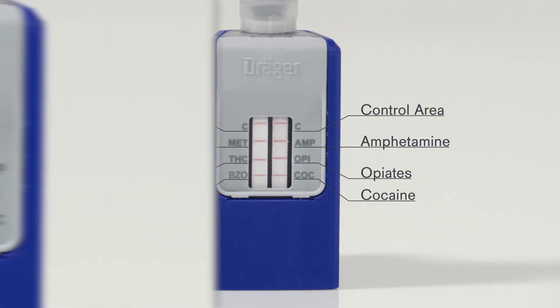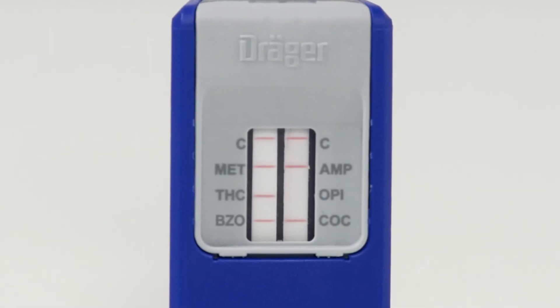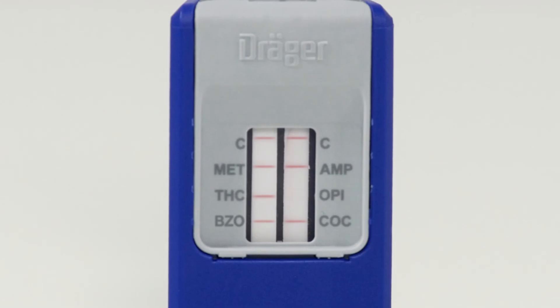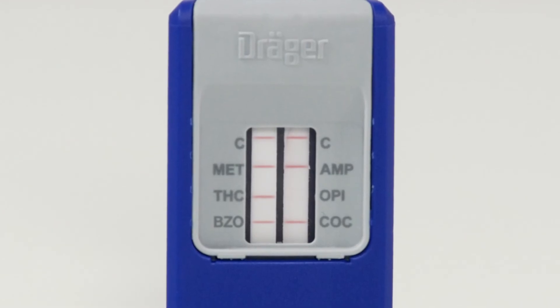If a line appears in the upper control area, but no line appears next to one of the substances, the test is positive. This test is valid and positive for opiates.